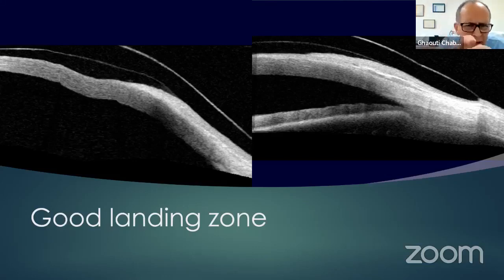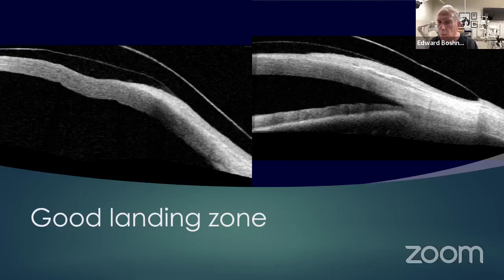I have seen most of your slides are, I think, full scleral lenses. It's a 16.5 or larger than that. Do you work with semi-sclerals or not? You know, I don't use the word semi-scleral. It's either a scleral or it's not scleral. It's either a woman is pregnant or she's not pregnant.